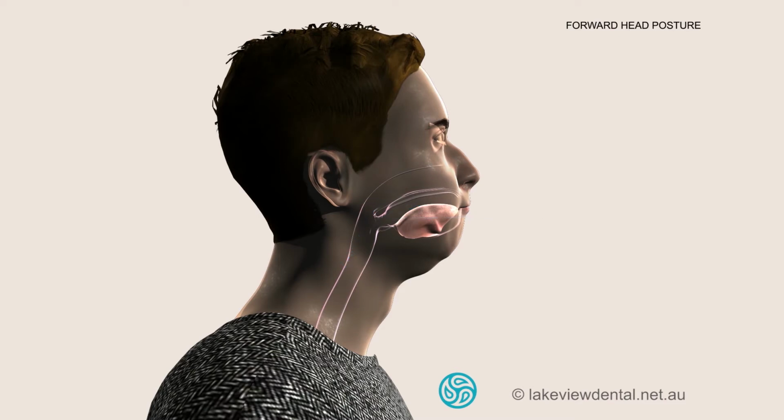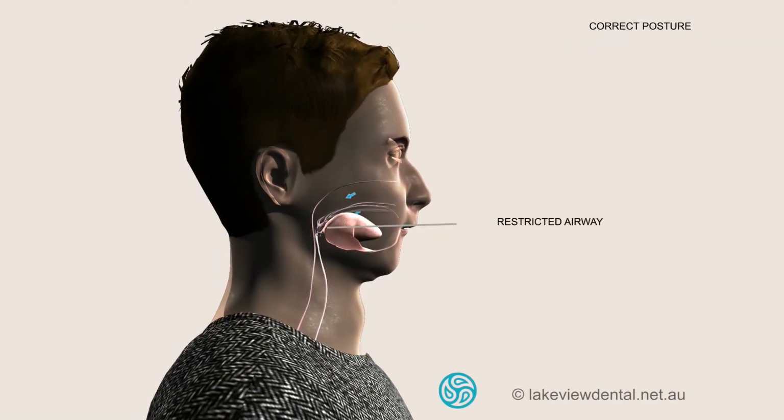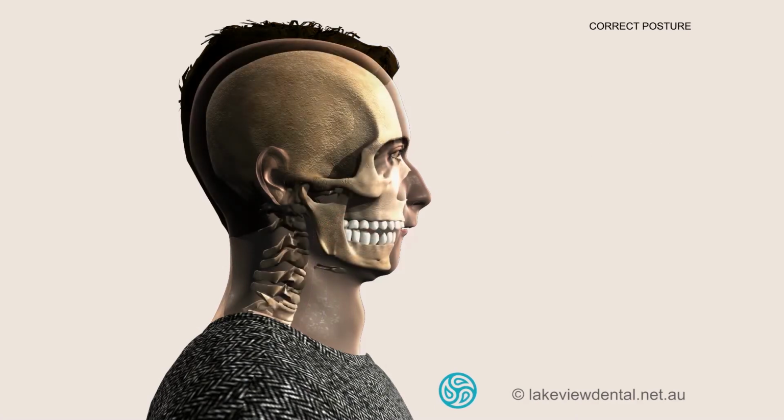Correcting the posture will allow for the head to derotate. The tongue goes back with the lower jaw, restricting the airway. The spine curve improves and the ear position is balanced over the shoulders, allowing for less neck muscle strain.